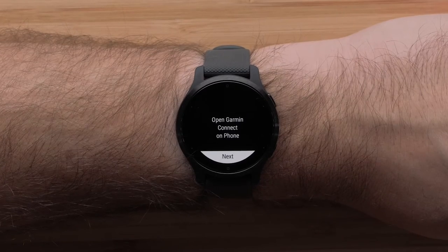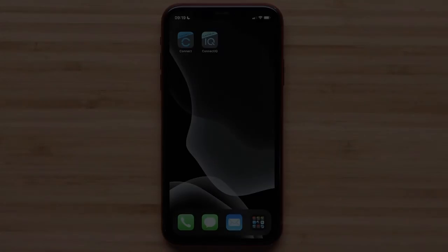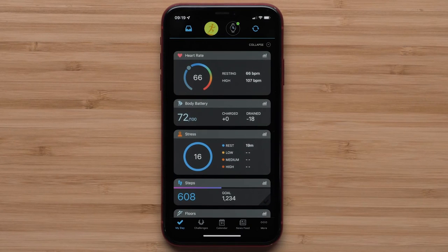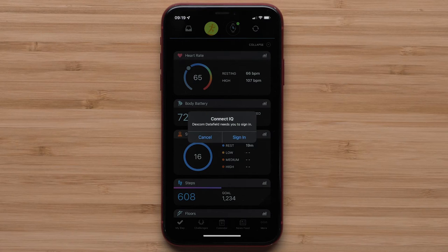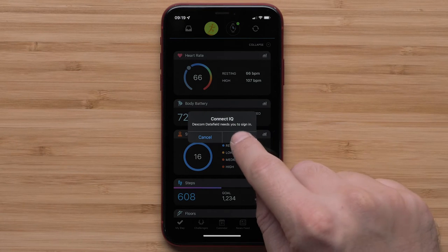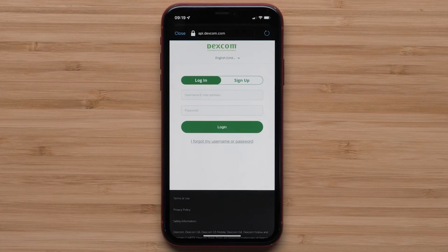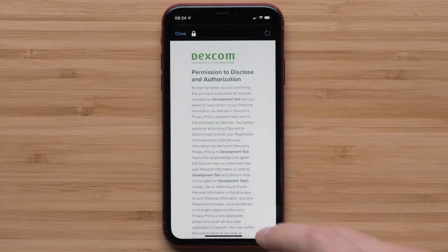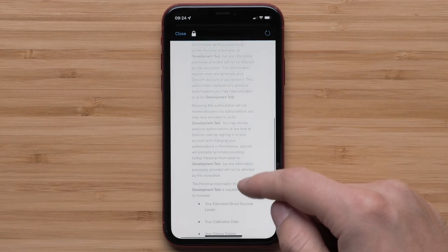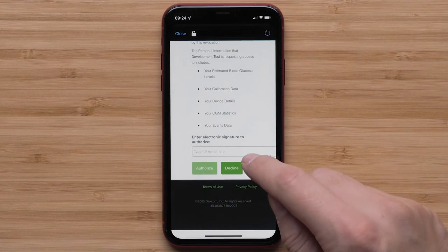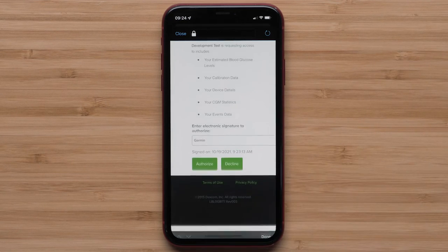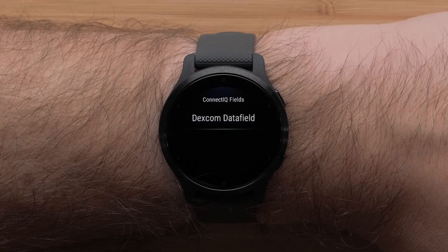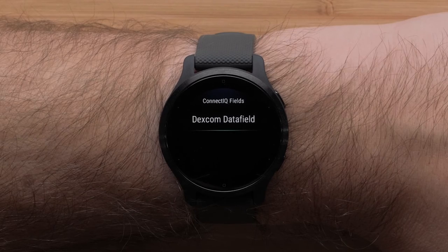When prompted, open the Garmin Connect app on your smartphone. Android phones will automatically open the Dexcom sign-in page. If you are using an Apple iPhone, select Sign In on the login prompt. Enter your Dexcom username and password to sign in. Select the usage terms and enter your name to e-sign. Then tap Authorize at the bottom. Once signed in, you can return to your watch and the sign-in will be complete.